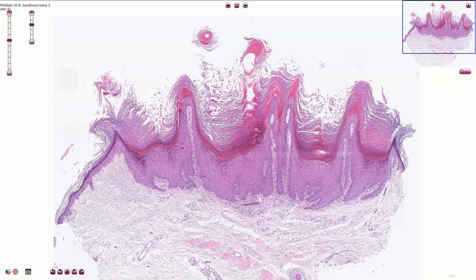Verruca vulgaris, also called a common wart, is a benign epidermal lesion associated with human papillomavirus infection. It can be caused by numerous HPV subtypes and very commonly affects the fingers and also the palms and soles. Sometimes we can find it on the face or on the dorsal parts of the hands.